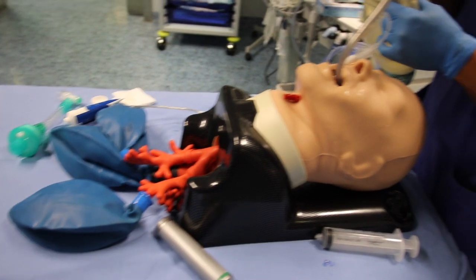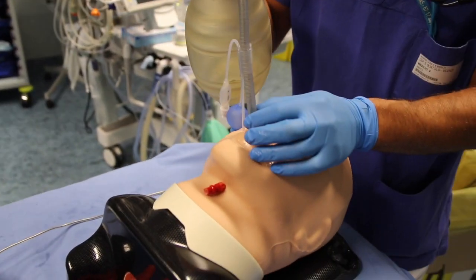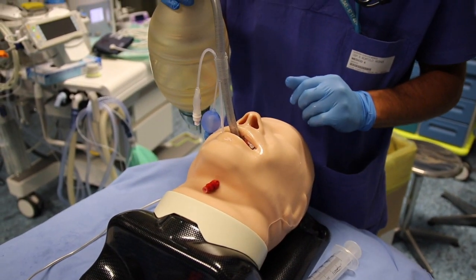Now that the Spritztube is placed correctly, it's working exactly like a supraglottic airway device. Next, we'll repeat the procedure with the help of a laryngoscope.